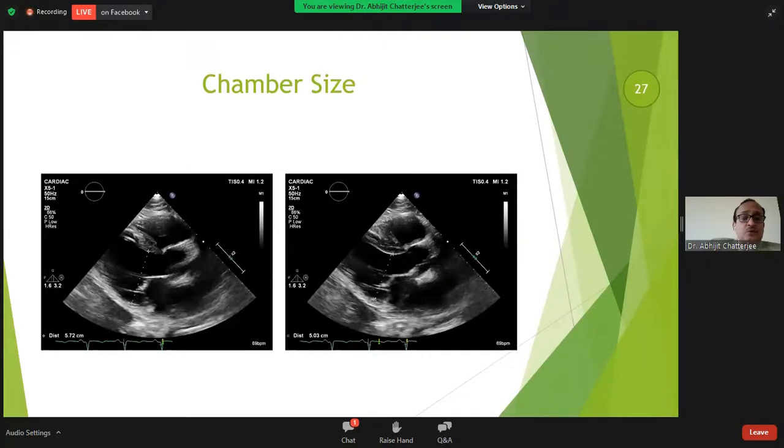See, this is how we do it at the tips of the mitral valve. And for young doctors who may happen to watch this, it is important to keep the junction of the aorta and the interventricular septum exactly in the midline and avoid foreshortening, so that the results are repeated over various examinations from time to time.